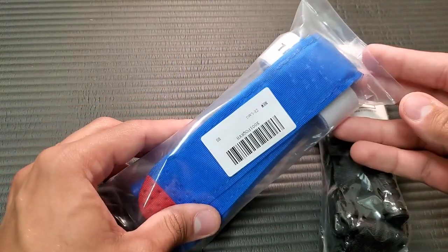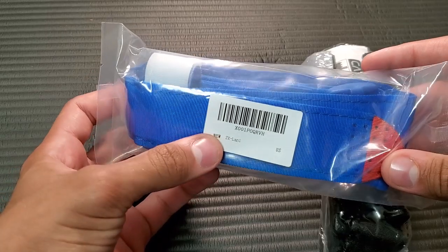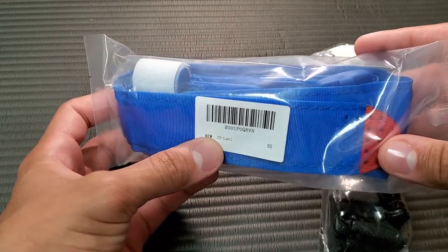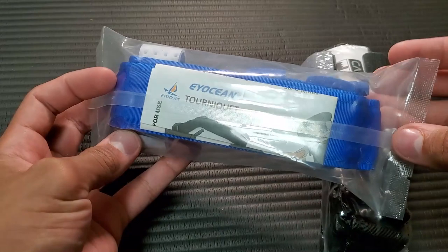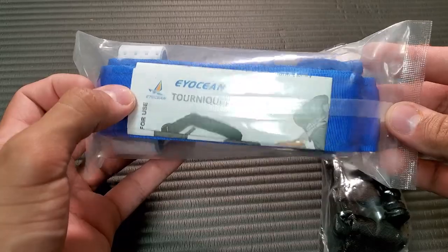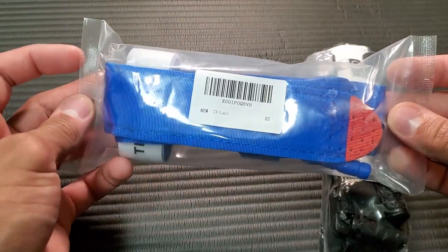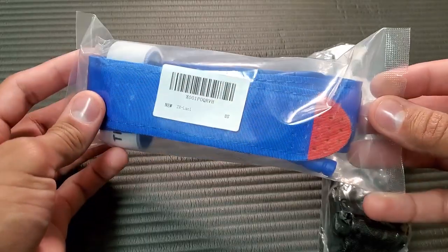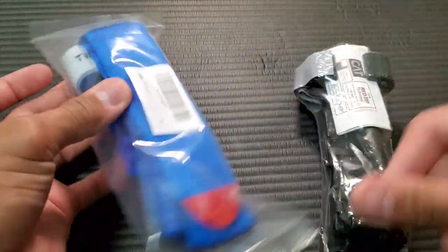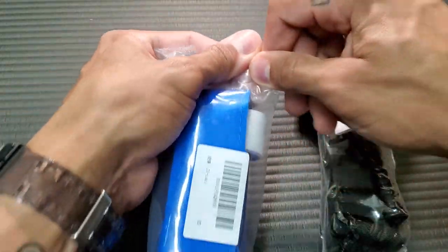And then here we have the $10 tourniquet. It doesn't really say much. I imagine it is a Chinese brand making these — it looks like it says Iocene. It's got a little rip perforation. Nothing crazy with the packaging, but it is what it is.